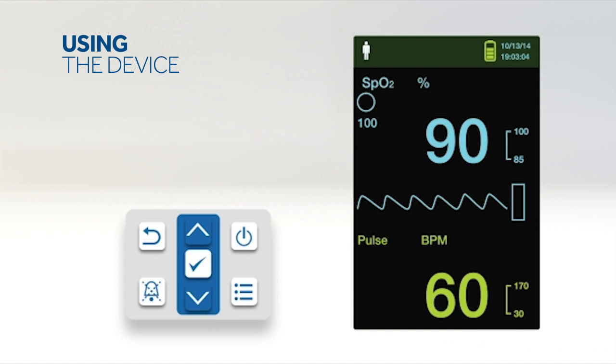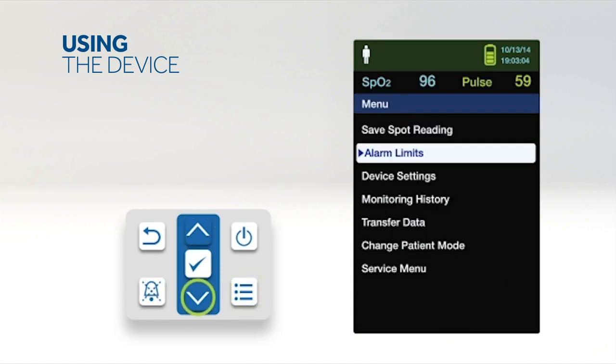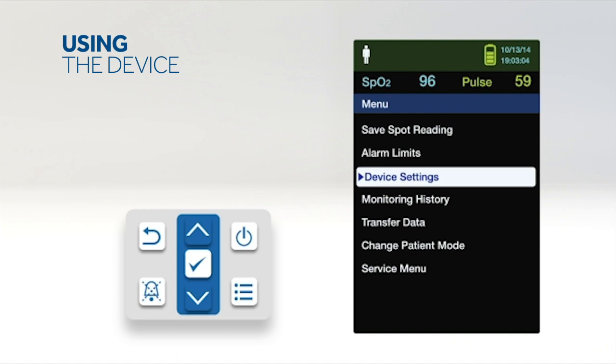Access the device settings menu to adjust the monitor's brightness and volume. To access the device settings menu, press the menu button, then press the up or down button to highlight the device settings menu, and press OK to select device settings.